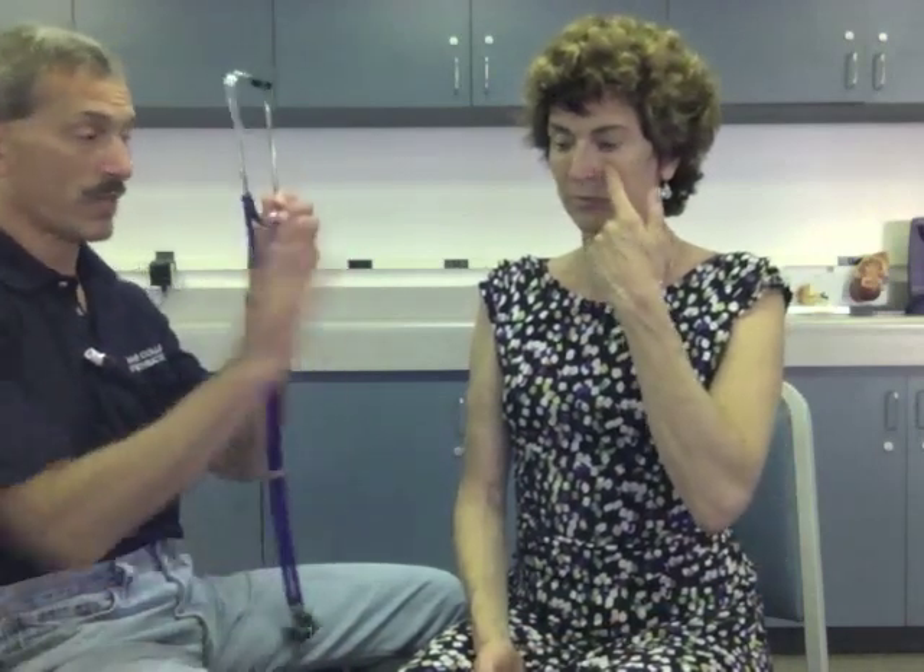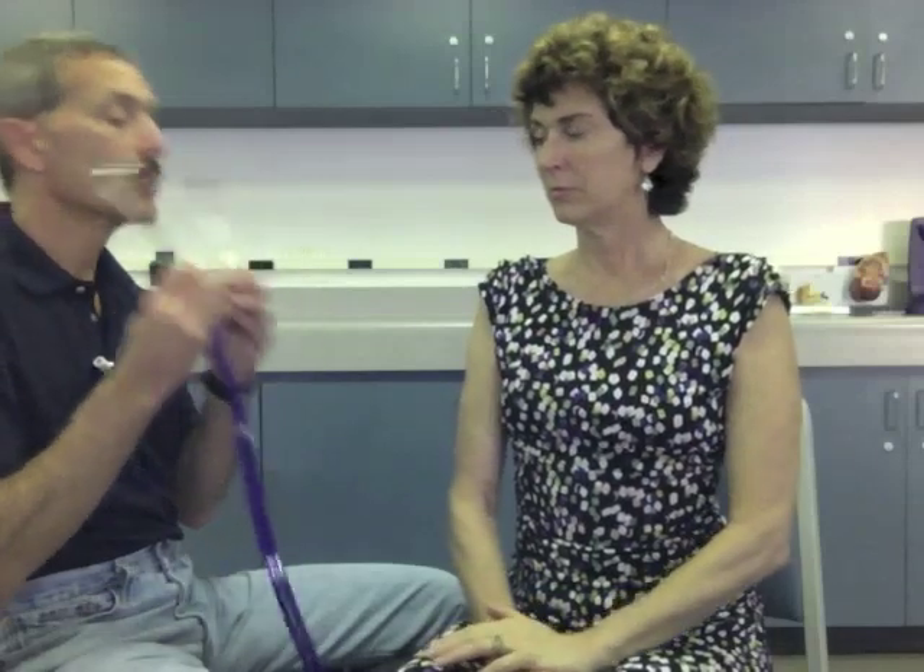Next I want to get a set of lung sounds. Normally I would do this directly on skin, but I'll show you the locations. I'm going to confirm my stethoscope works. I'll auscultate at the second intercostal space — open your mouth and take a deep breath, ma'am, in and out. Then at the fifth intercostal and axillary — one more time, in and out — and then posteriorly at the base of the scapula, both sides, in and out. Patient has clear lung sounds in all fields.